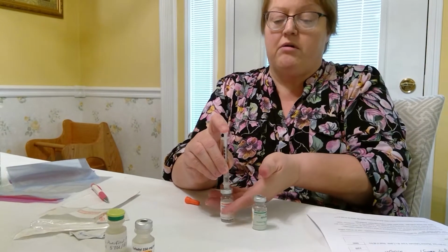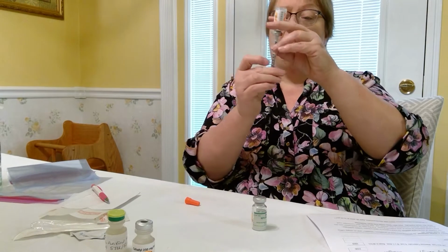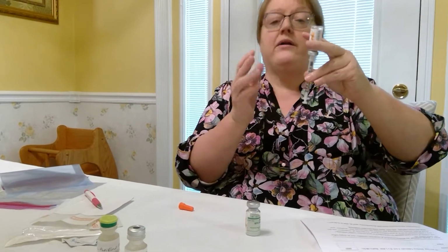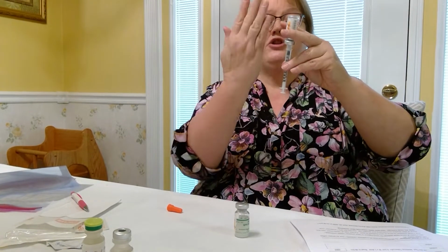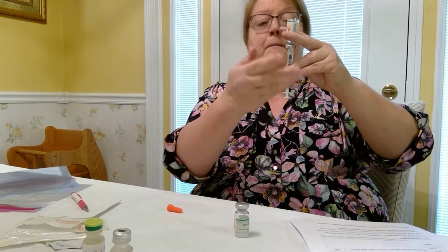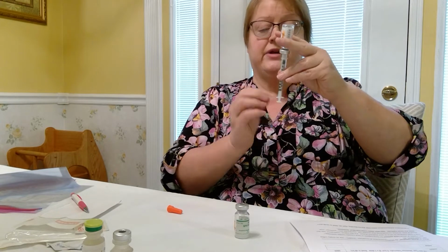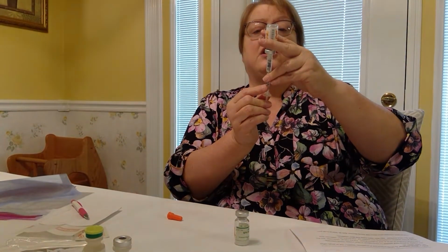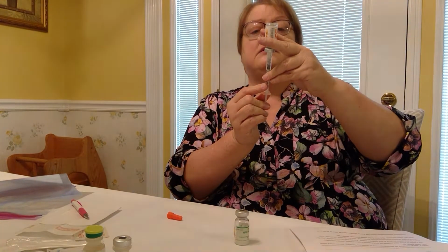Now I'm going to draw up the R by inverting and holding it in this manner. Whatever manner you want to use, as long as you keep it perpendicular and that you don't bend the bottle and possibly bend your needle. And I'm going to draw up 16 units. Slowly pull back.